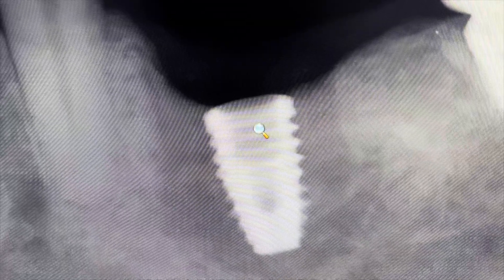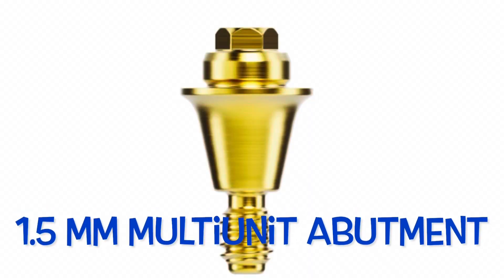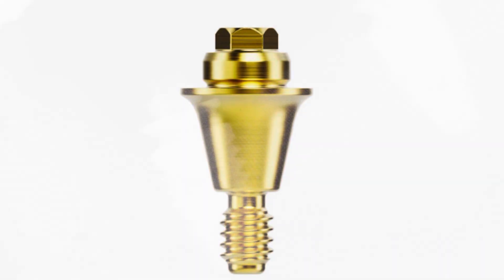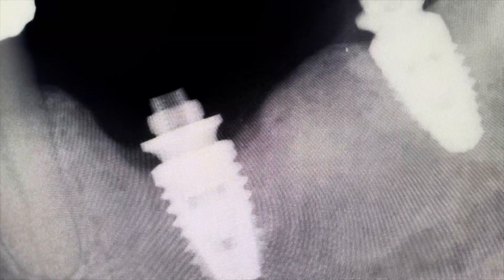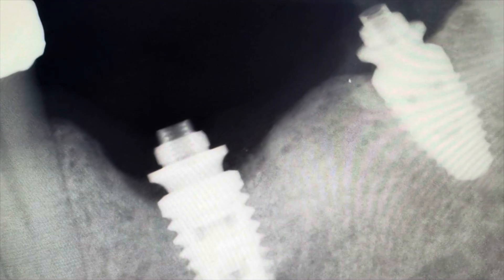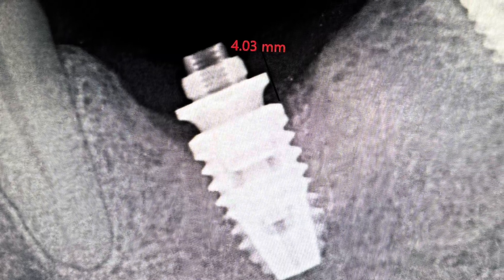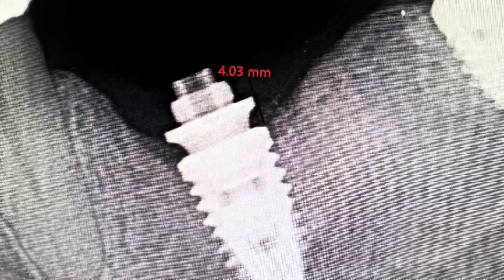On this type of bridge I'm typically placing two implants to do a three-unit bridge with one pontic. What I like to do is to have the platform protected by putting on what's called a multi-unit abutment, and typically this is 1.5 millimeters high. Ideally the implant platform depth is going to be four millimeters below the tissue level, which gives us the space for the multi-unit.